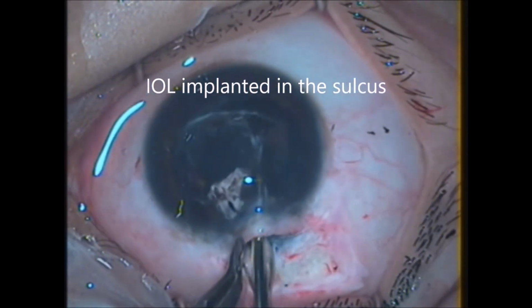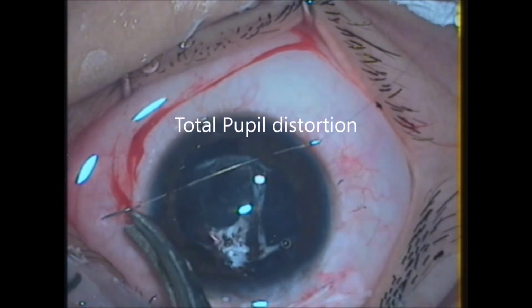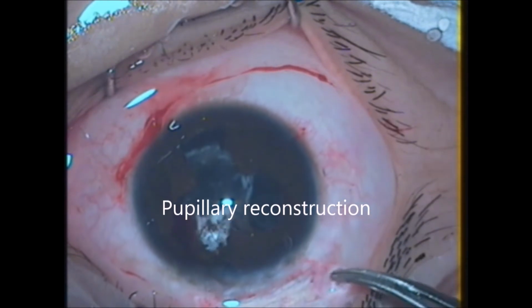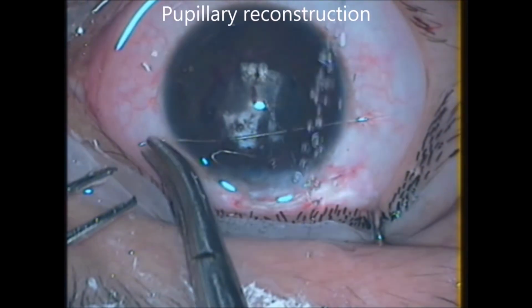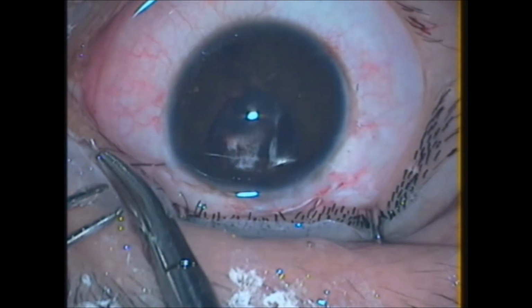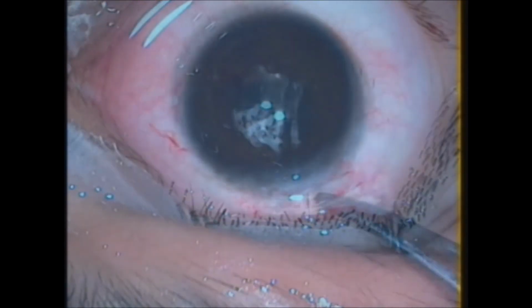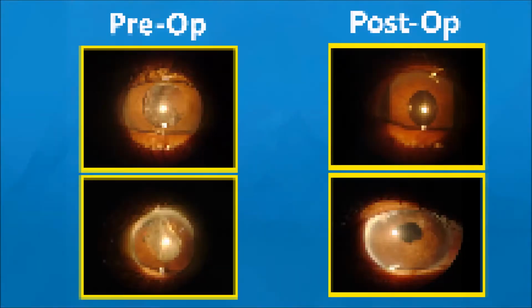Another new IOL was implanted in the sulcus, but while doing this, the pupil was distorted. So pupillary reconstruction was done with 10-0 Prolene suture by slip knot technique. A round circular pupil could be achieved. The IOL could be placed near its home.